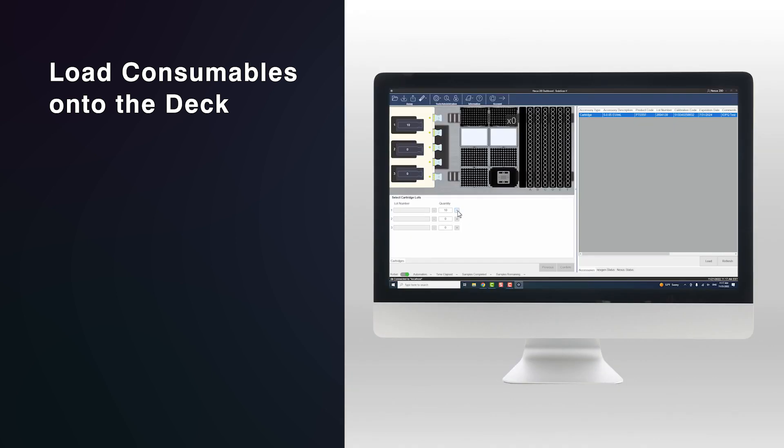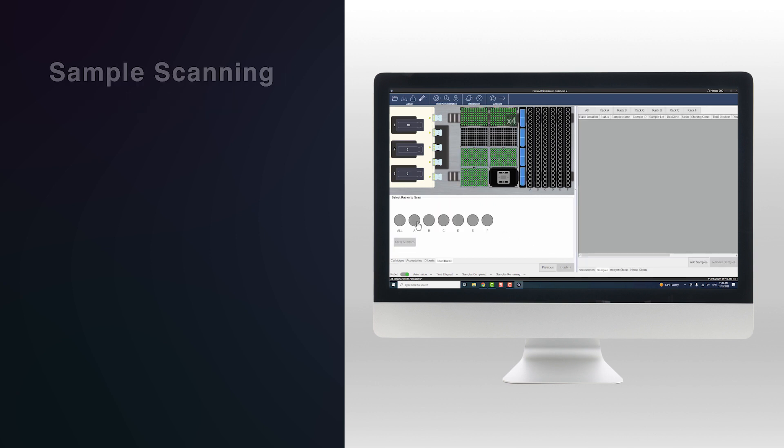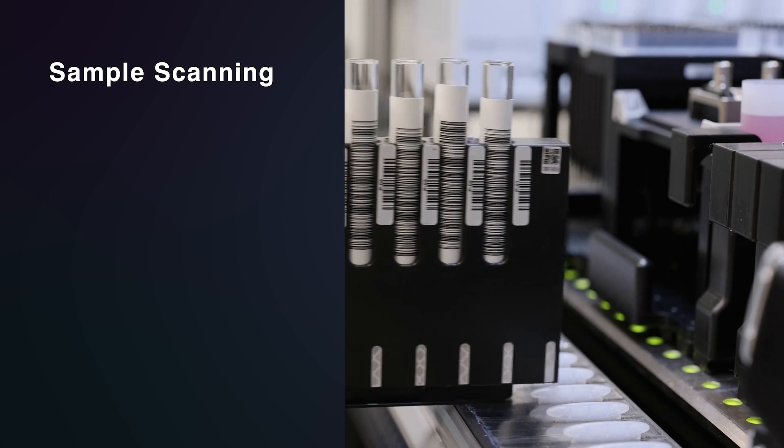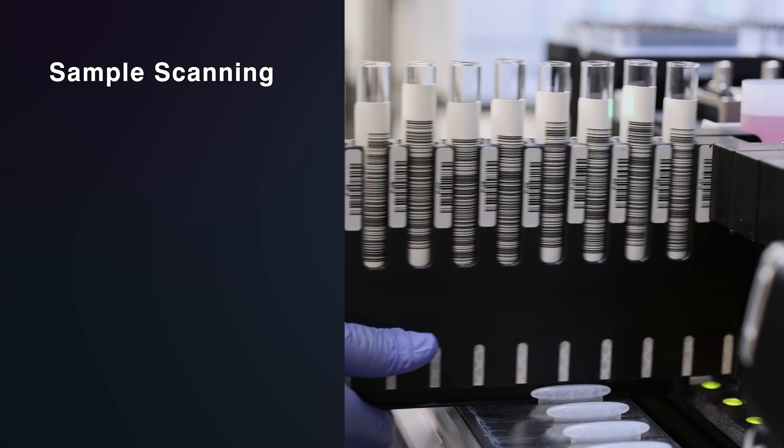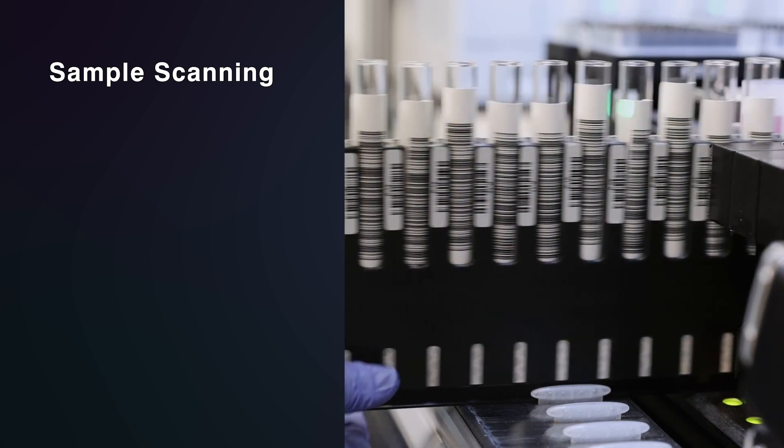Confirm the cartridge and accessory lot numbers and enter them into the user interface. Next, prepare for sample tubes to be scanned. When the run is ready, select in the software which sample racks are to be populated. Then the samples can be scanned. The on-screen prompts provide instructions for loading the racks onto the deck.